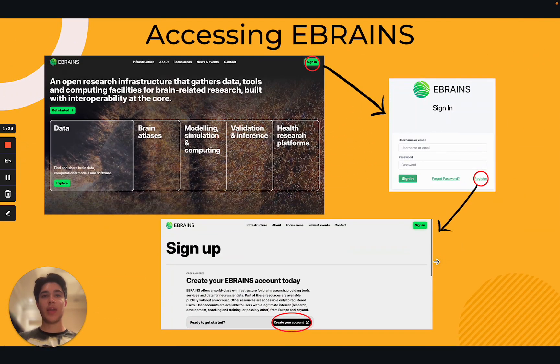To find the eBrainz database, simply type eBrainz.eu with no spaces into the search bar of your preferred internet browser. Once you've reached the eBrainz homepage, click the sign-in button that will appear in the upper right corner of your screen.